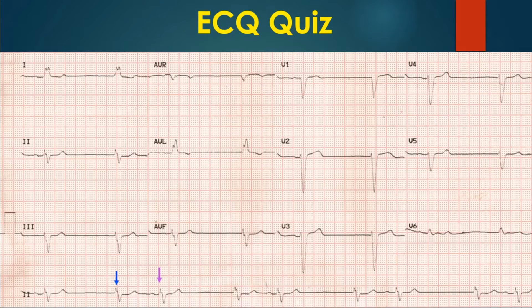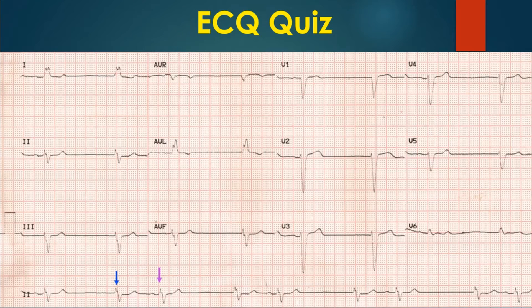The rhythm strip shows sinus bradycardia with junctional escape beats marked by blue arrows, without preceding p-waves. They have the same QRS morphology as the succeeding sinus beat marked by the violet arrow. The sequence of junctional escape followed by a sinus capture beat continues throughout the rhythm strip. This constitutes an escape capture bigeminy.